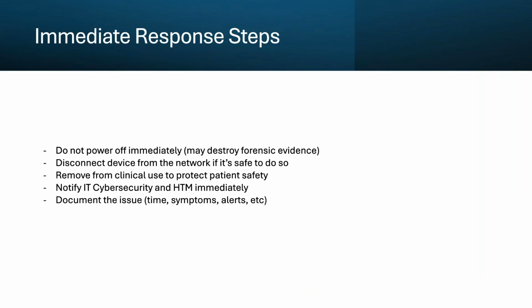Notify IT, cybersecurity, and HTM immediately. Time is critical. The faster our team responds, the better we can contain the threat and minimize the damage. Know your facility's escalation procedures and contact information before an incident occurs.